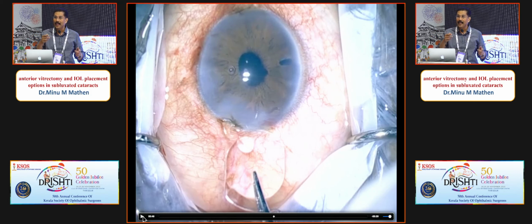No, what to do? So I finally explanted that lens, took it out and saw the alignment. Okay, anyway, actually it was flipped. But then anyway, I took it out and placed it once more.